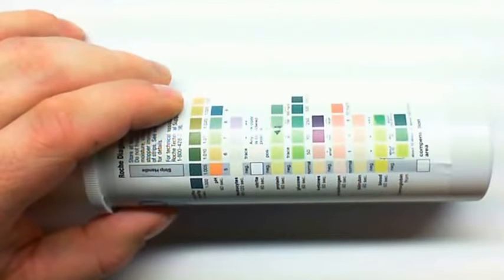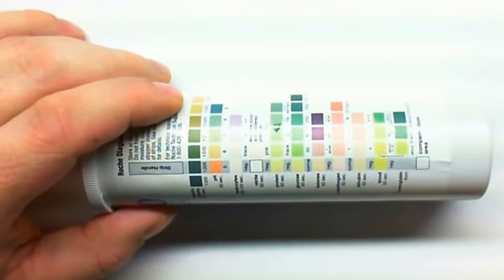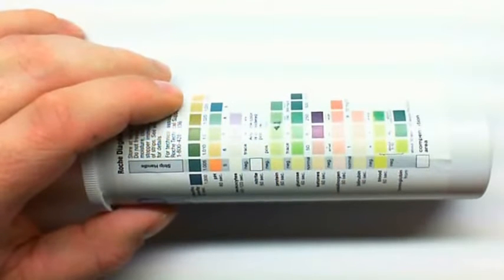And the reason is because I want to point out that it's not so much the individual tests that reveal something in urinalysis, it's the comparison of the tests that reveals something. Urinalysis is a relatively non-invasive way to get hints at various pathologies, everything from hemolysis, liver disease, diabetes, hypertension, preeclampsia, biliary obstruction, things like that. You can get a hint at those just by comparing the results of the various tests.